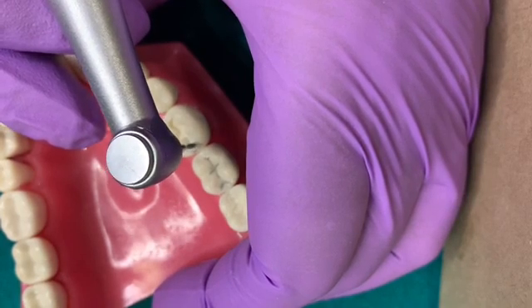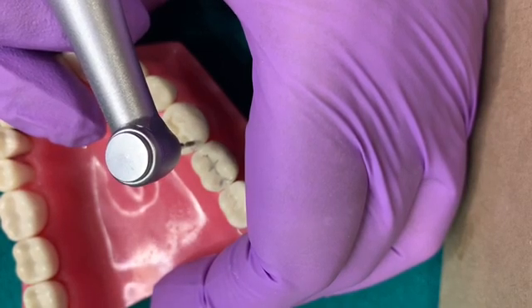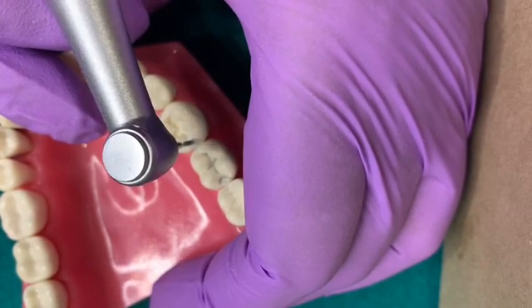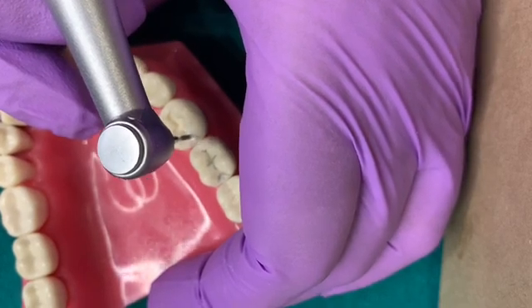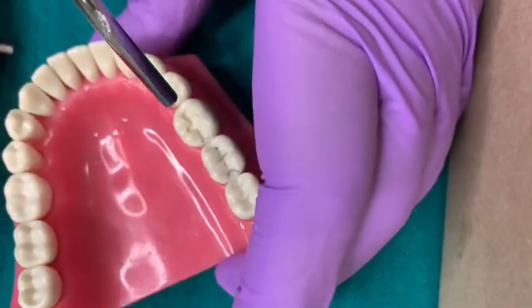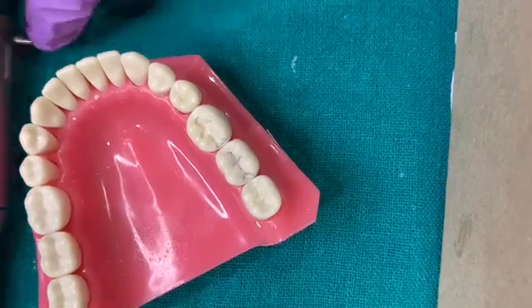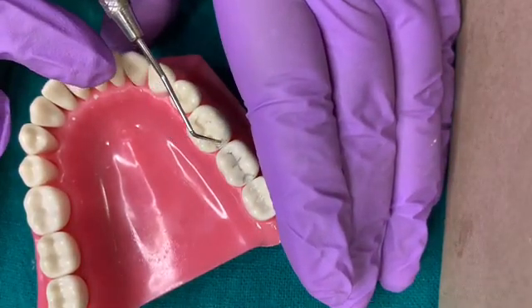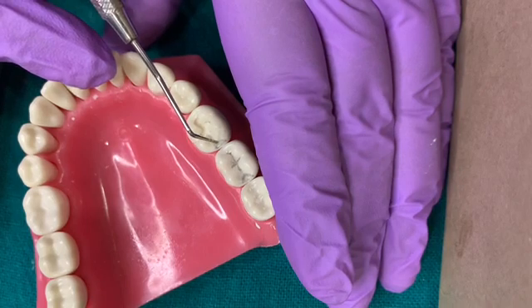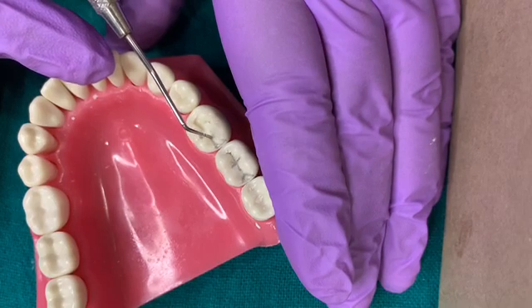I am moving in a buccolingual direction as I proceed distally because my buccolingual area has to be widened as compared to the remaining cavity. In this manner, I slowly cut towards the distal marginal ridge. A very thin portion is just left, but at this moment the pulpal floor in this area is raised — it is not deep enough. So I have to first get it to the same depth as the rest of the cavity.